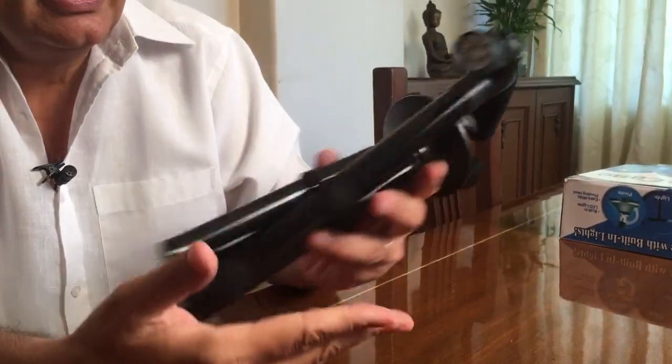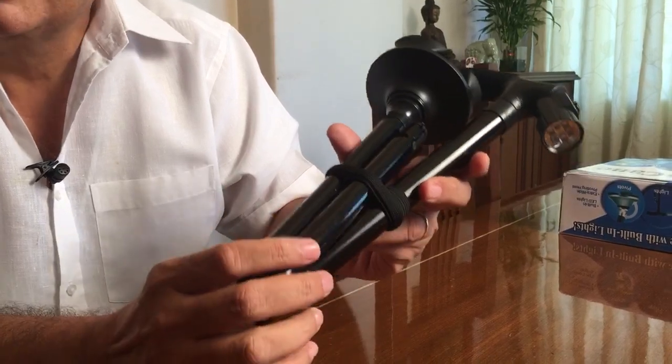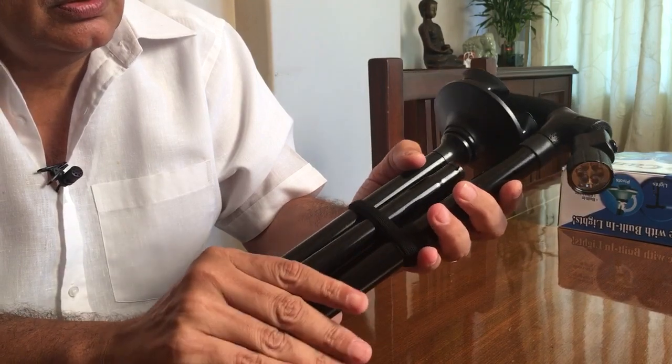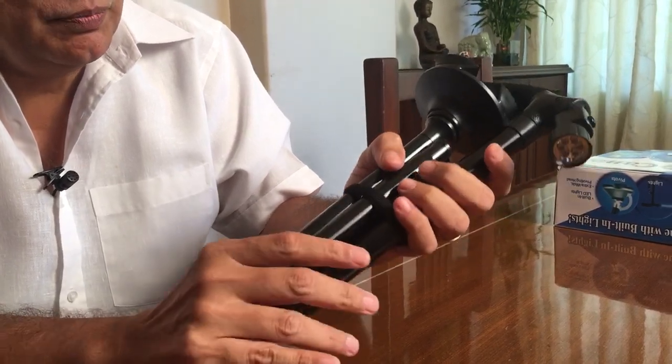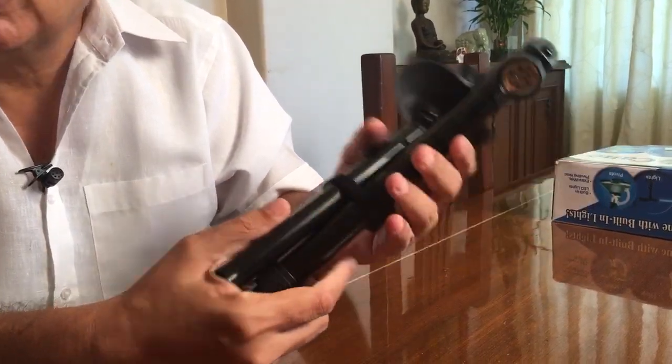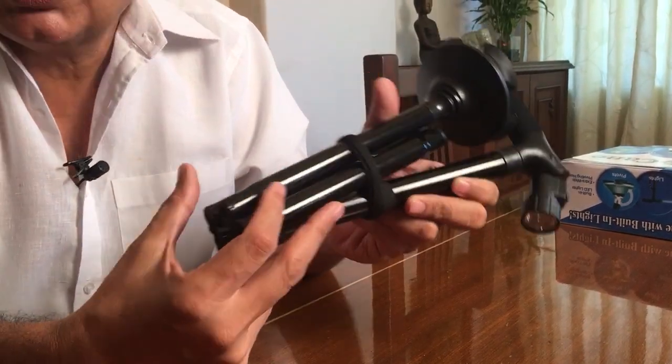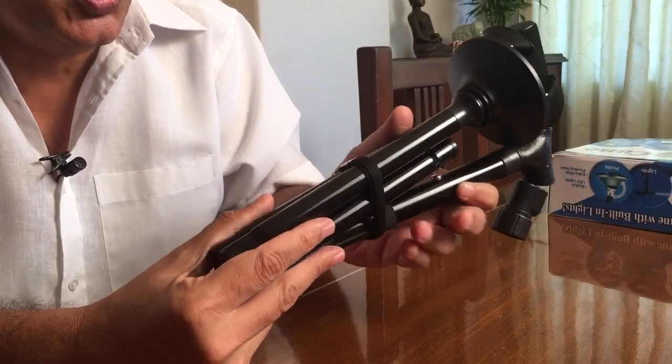As you can see, this cane folds into a very small product, therefore the storage of this cane is very simple. You could just put it away in your bag when not in use.